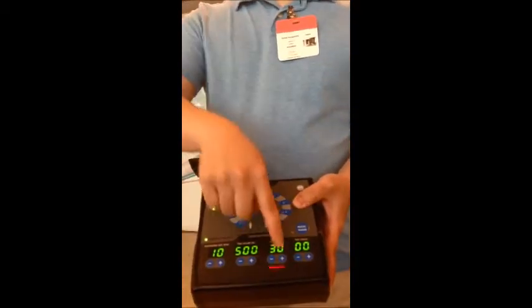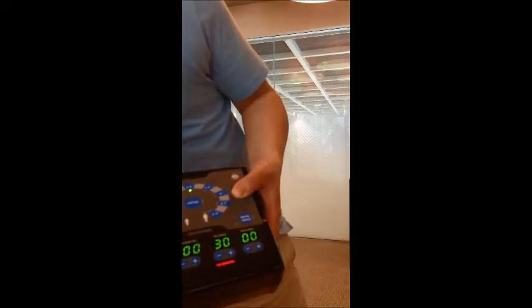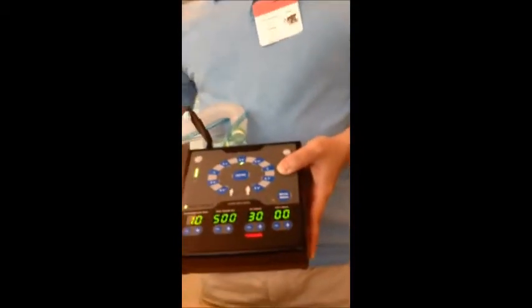So right now we're hitting a peak pressure. We're hitting the pressure in the lung. It's a little too high, so we'll adjust that. Is there a fake lung? This is a fake lung here. So now that the pressure has been relieved in the patient breathing circuit, it is now delivering.